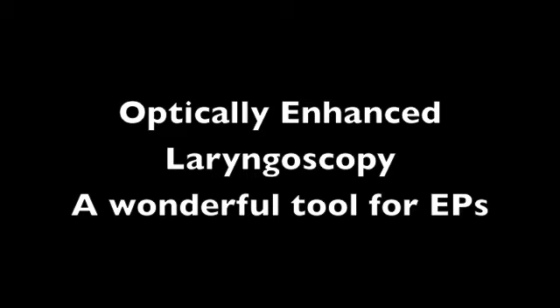So we've covered a lot of ground today, from preparation to topical anesthesia, sedation principles, and the use of the endoscope, and also direct and conventional laryngoscopy using awake techniques. This is a wonderful tool for emergency physicians and is, as you can see from the video, very accessible to everyone. All of us are facile with video laryngoscopy, and now with the advent of technology allowing us to have video endoscopy at the bedside, it can be a wonderful adjunct. It might save your butt and might even save a life or two along the way. So thank you for your time and enjoy.